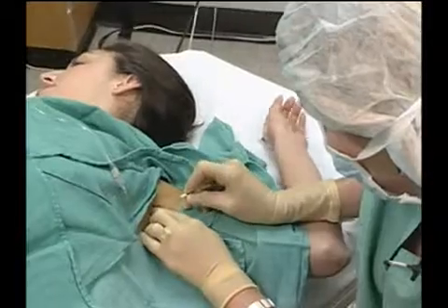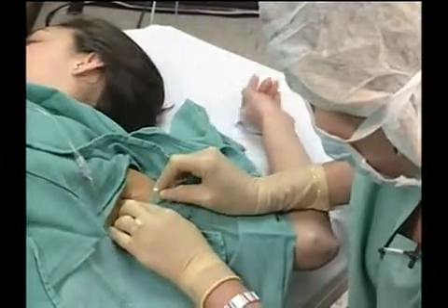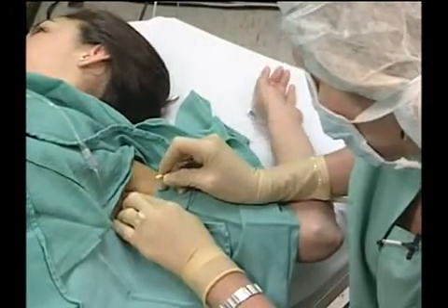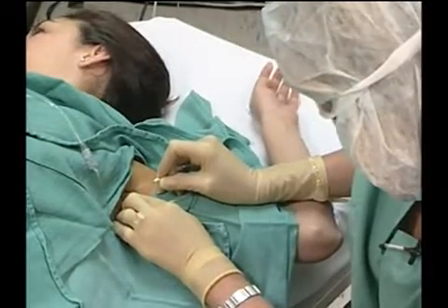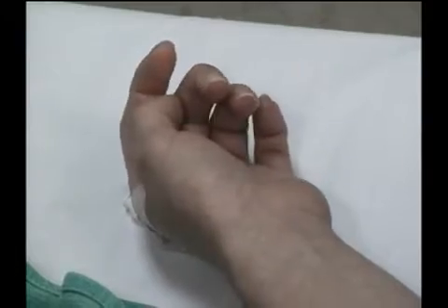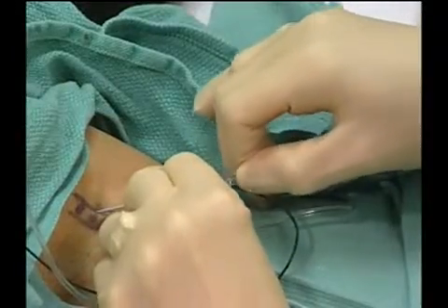A musculocutaneous response is elicited, indicating that the needle is too deep and outside of the brachial plexus sheath. The needle is withdrawn, and this results in a stimulation of the median nerve response, as indicated by the flexion of the first 3 fingers. The local anesthetic mixture is injected, and the catheter is then introduced.